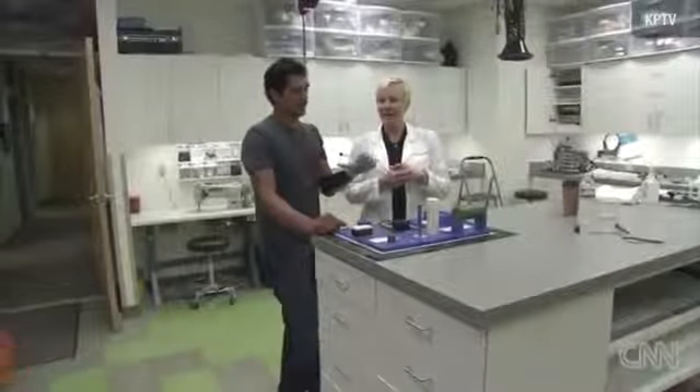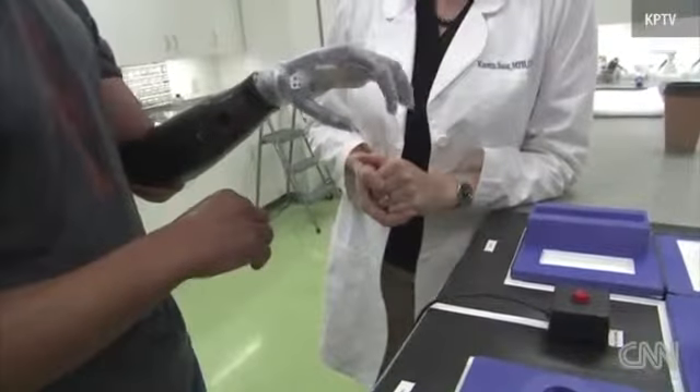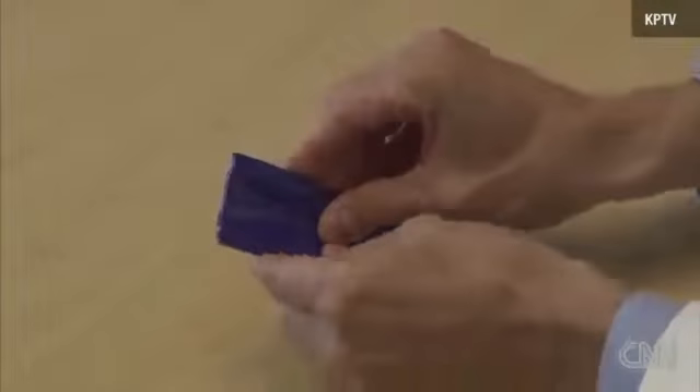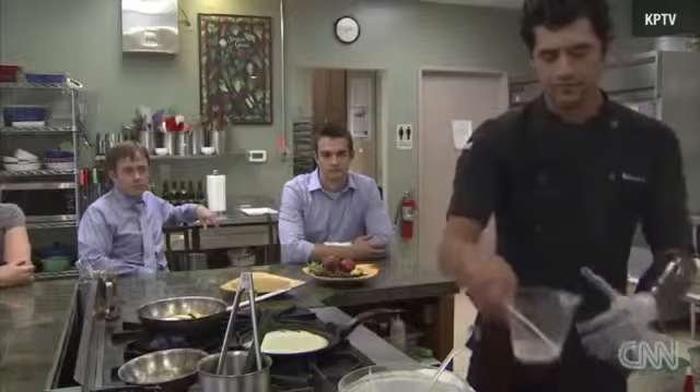Precision, pinch — and the prosthetic does not weigh Garcia down. His bionic hand is about the same weight as his real hand. It is made of silicone and carbon fiber and fitted with lightweight lithium batteries that can run an entire day without being recharged. And if Garcia can no longer flick his wrist, he can at least twist it.